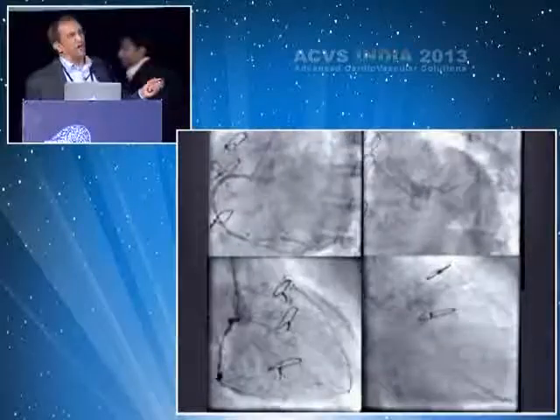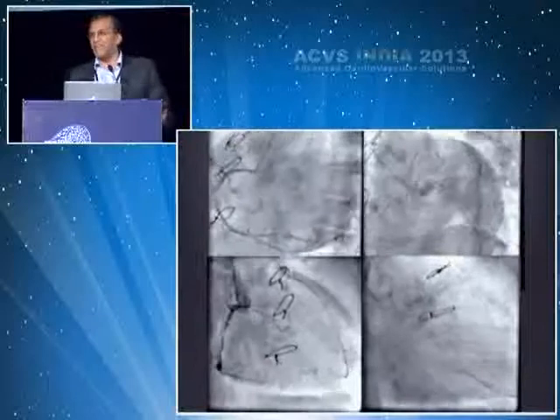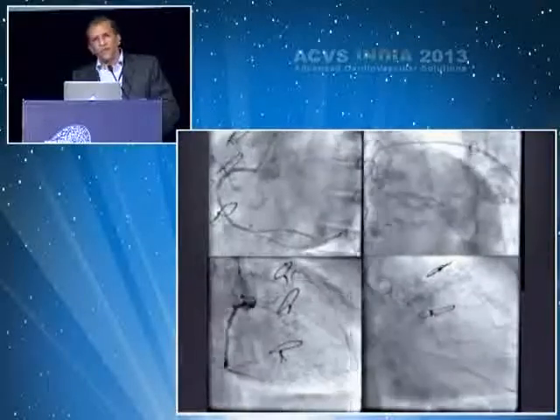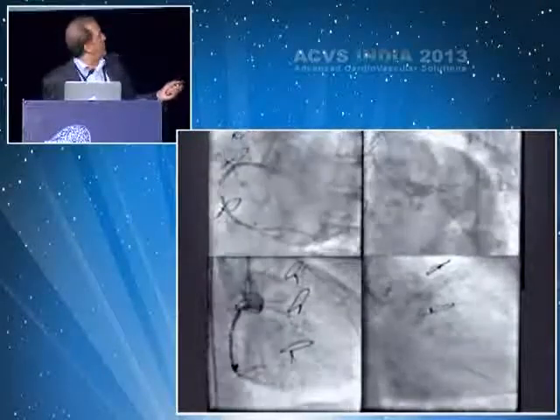The left system is a very short left main and an ostial occlusion of this, at least 5 years that I know of, and probably from the time of surgery, which was from 2004. So this was almost a 9-year-old total occlusion that we're talking about.